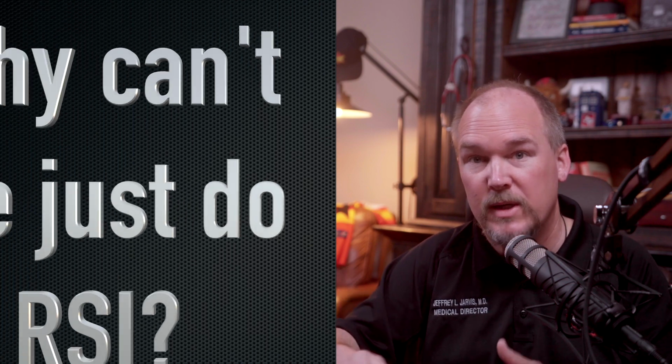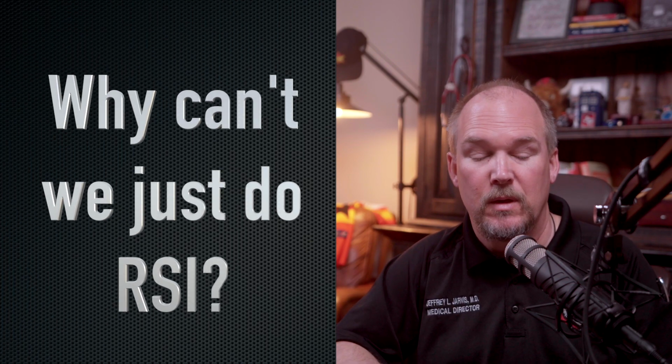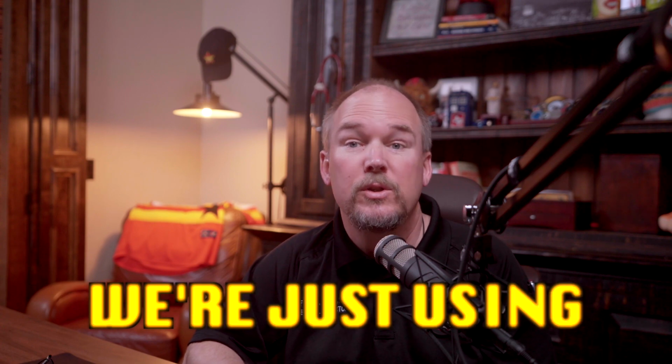But I do want to go over a couple questions I typically get around this concept. If we're doing RSA for supraglottic placement, why can't we do RSI for intubation? Well, you can. We're just using a safer version of RSI called DSI. This is one that is built around assuring you maximize the opportunity for a safe intubation and a first pass success without hypoxia or hypotension.